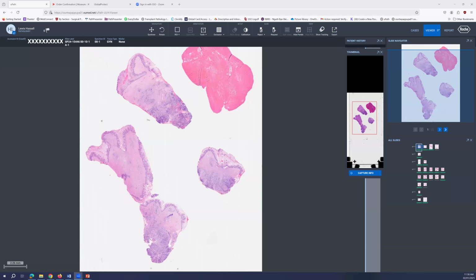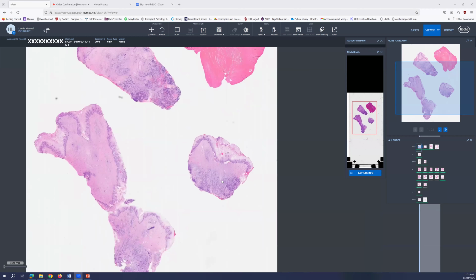The first sample that we received on this patient was a vaginal mass biopsy, which, as you can see here, is represented at low power and shows some intact squamous mucosa along the surface, and then areas of bluish discoloration in the deeper portions of the tissue.